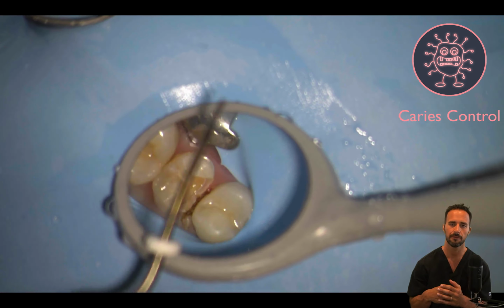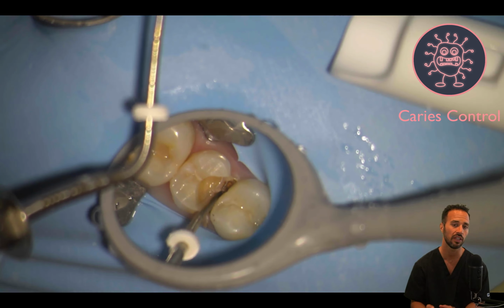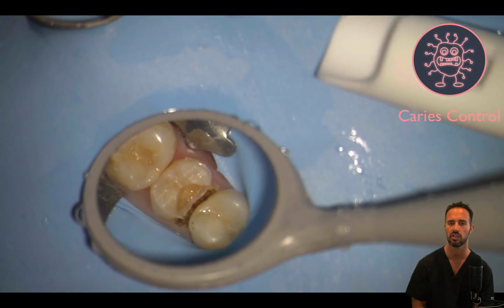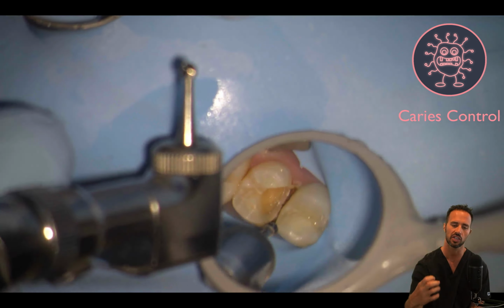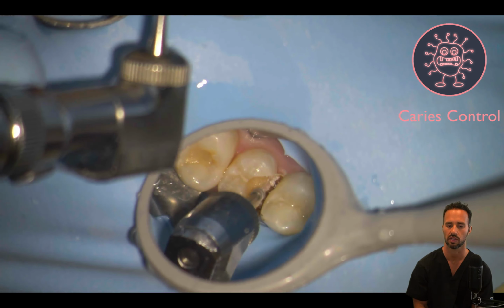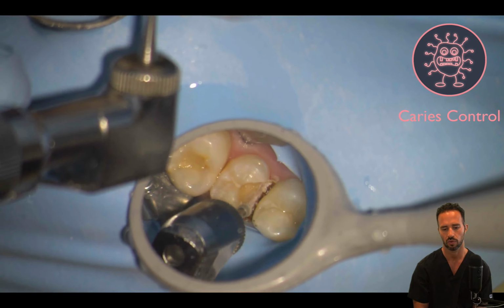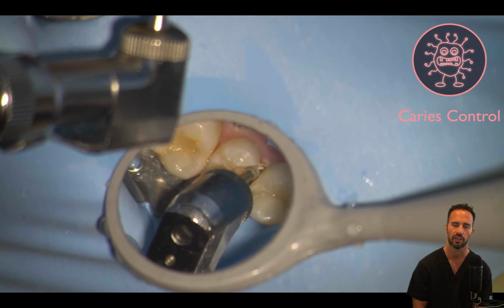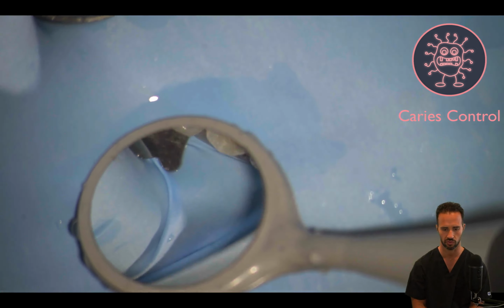The patient will likely smell some burning of the gingival tissues. They won't feel anything because they're obviously anesthetized, but that smell can be a little startling to a patient. So I like to have the assistant hold the high-speed suction close by to try to evacuate as much of those fumes as possible. And here I'm just using my number 4 round burr to actually just remove all that caries interproximally. All right, so we're still working on our caries control.